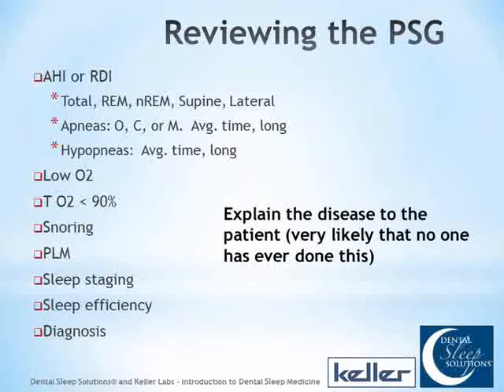We review this, and the things on the screen, you can read them for yourself. The AHI or RDI are, of course, mandatory to know. And, you read the other items, a supine AHI higher than prone or side AHI to me is a positive predictor of treatment.